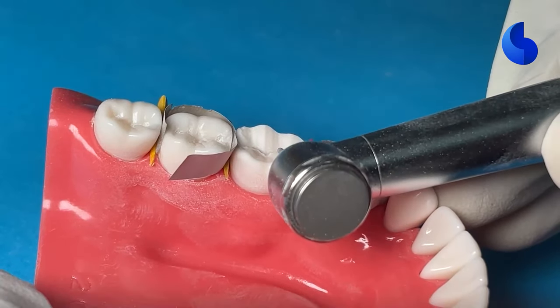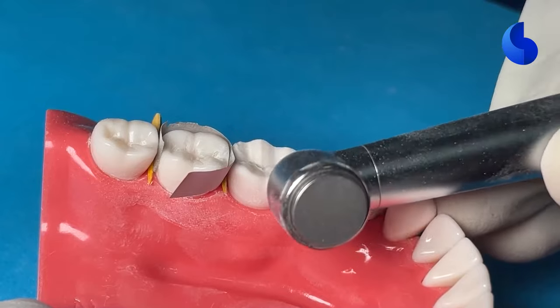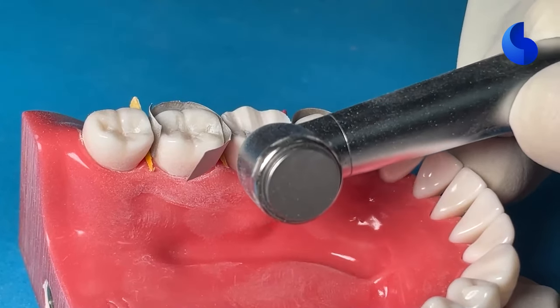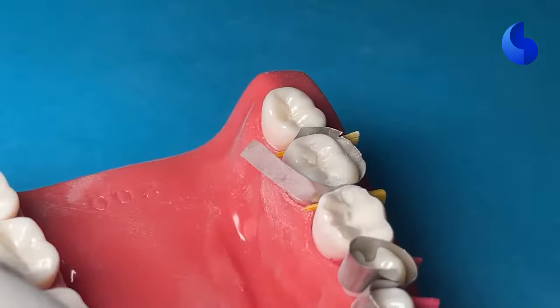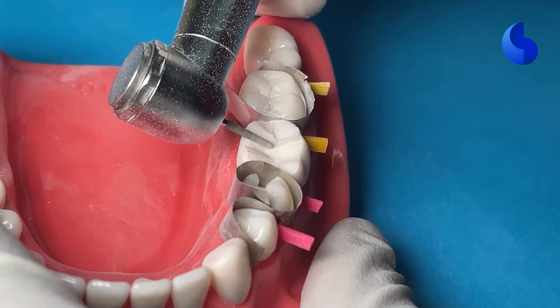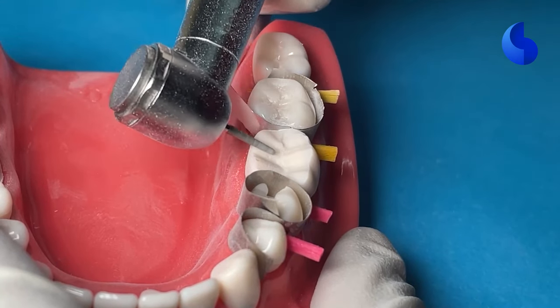On the lingual side, we're showing you a different technique of reducing the occlusal surface, which is the planar method. So the planar method of reducing tooth structure basically doesn't involve depth orientation grooves. You go to one plane. So right here, we're doing the mesiolingual cusp, and we're doing it on the distal slope. So you're basically just reducing it as you go without depth orientation grooves.